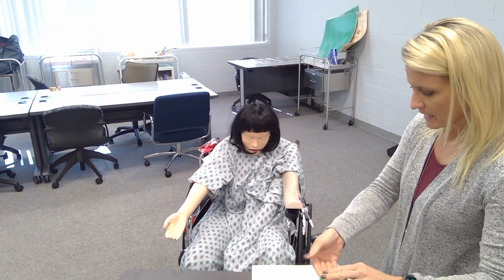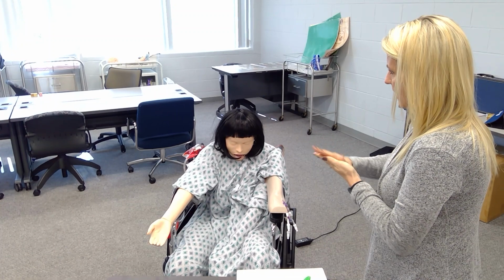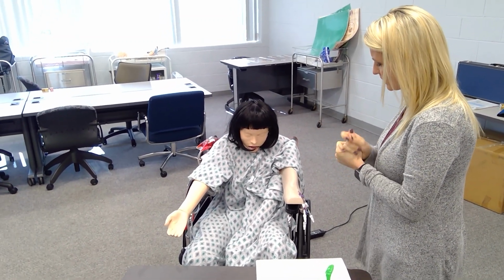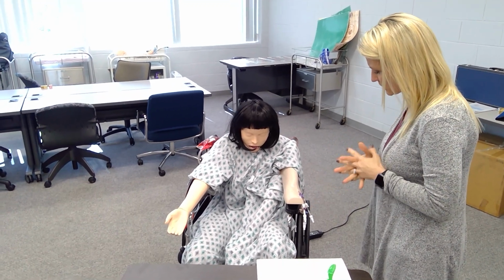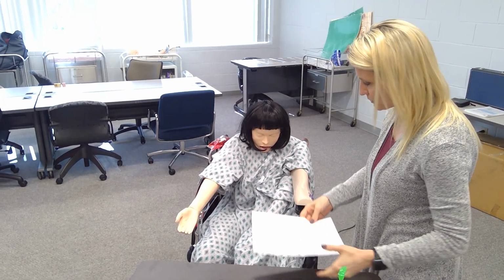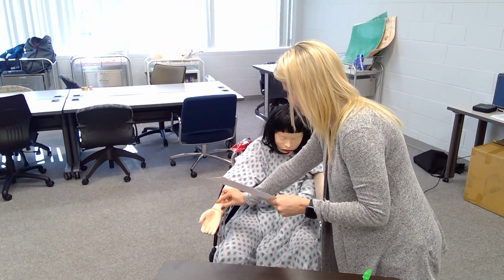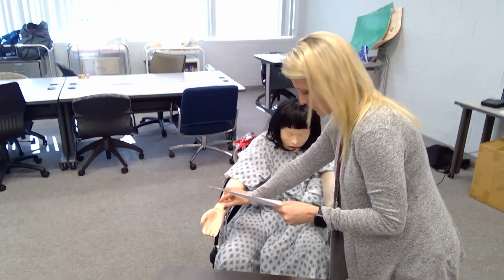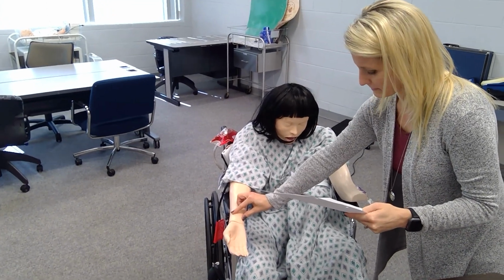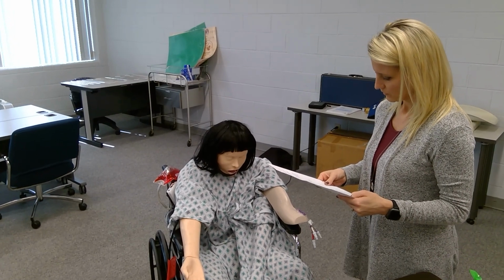Okay. Let me wash my hands real quick. And I have verified my order that says that I need to draw a complete blood cell count. And I'm not going to stick you in the arm. We're just going to simply draw it from these tubes right here that are coming from your PICC line. Can you tell me your name and your date of birth? Yes, my name is Sarah Lynn, and I was born on January 4th, 2001. Okay. And do you have any allergies? I don't think so. My mom's never told me I was allergic to anything.